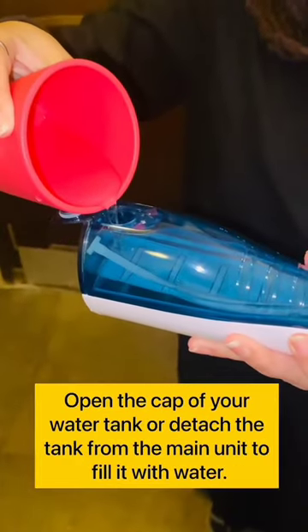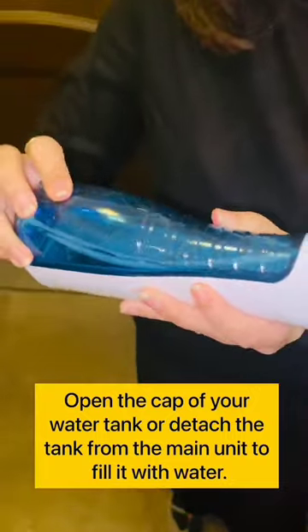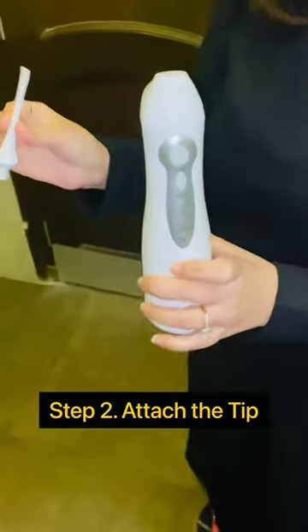Step 1: Fill the water tank with drinking water. Open the cap of the water tank, or detach the tank from the main unit, to fill it with water.